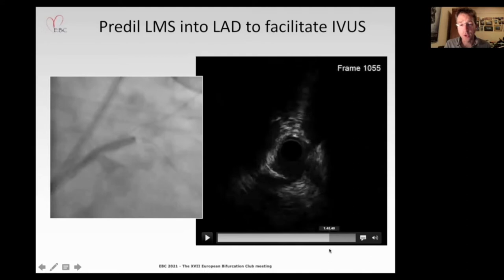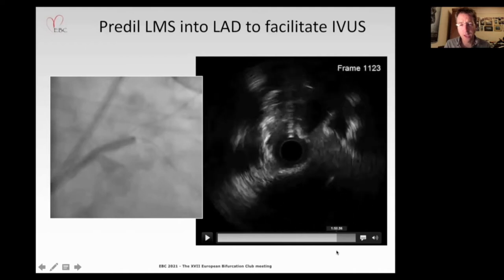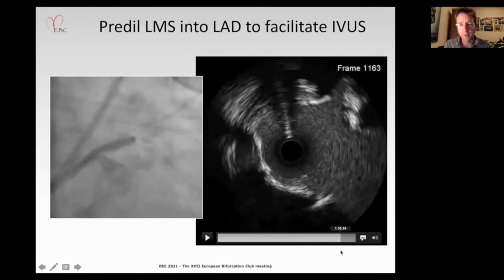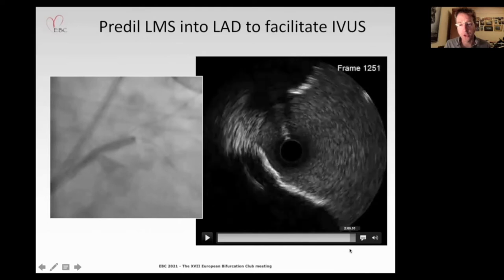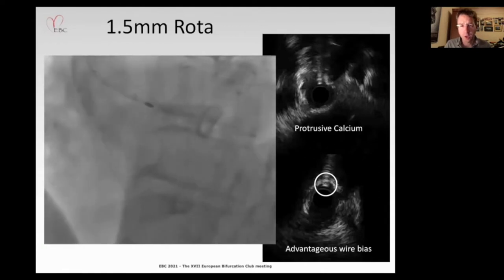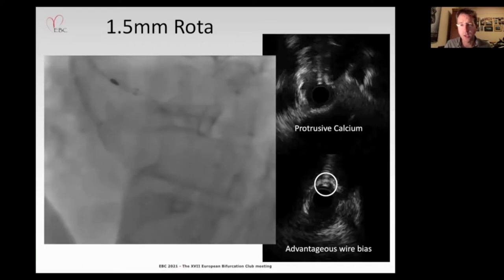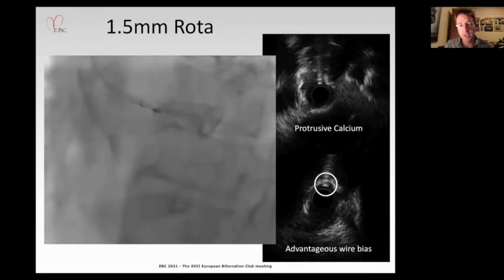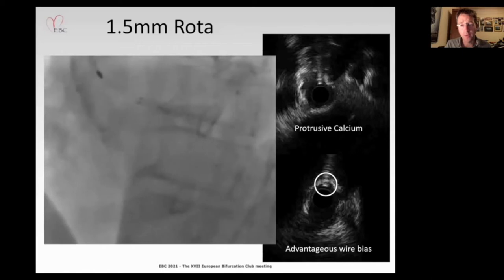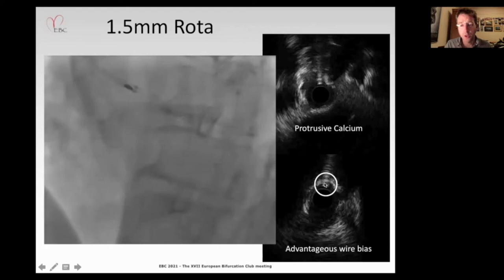The IVUS reveals a quadrant of calcification from 2 through to 4 o'clock as we come through the proximal LAD. The circumflex wire appears at 7 o'clock, and then a higher burden of calcification within the body of the left main stem — not quite circumferential — as we come back to the ostium where that exquisitely tight disease was seen, with some disruption from initial ballooning. There is nodular calcium at the level of the ostium to the left main into the aorta.